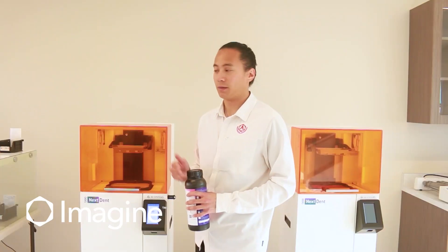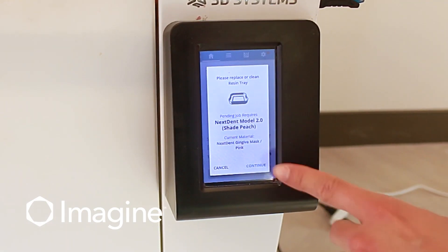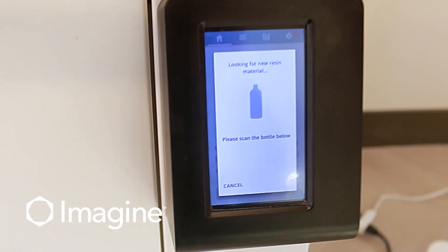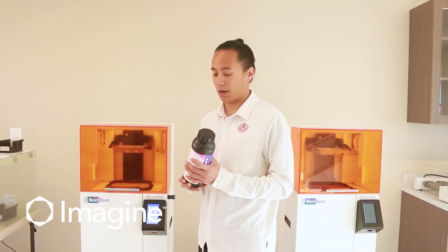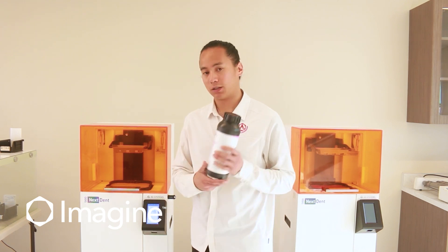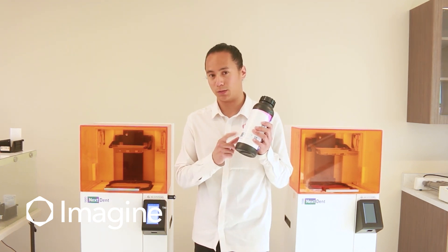It's going to confirm that we have the correct material inside the printer, which we do. From there, we're going to have to scan our bottle. For this one, we're going to be printing with Model 2.0 in the peach shade. You're going to notice a couple of QR codes on the bottle's label — typically, we always use the front QR code.